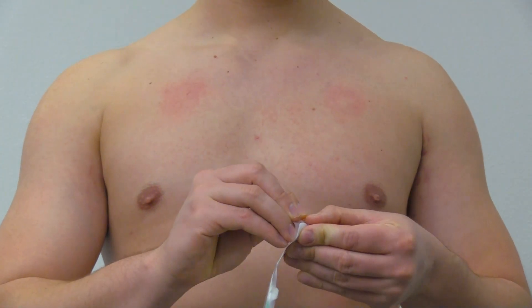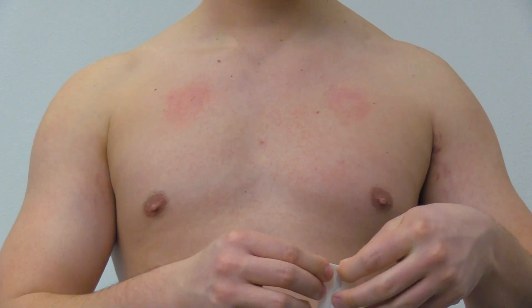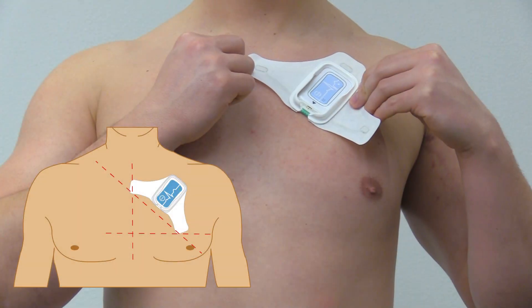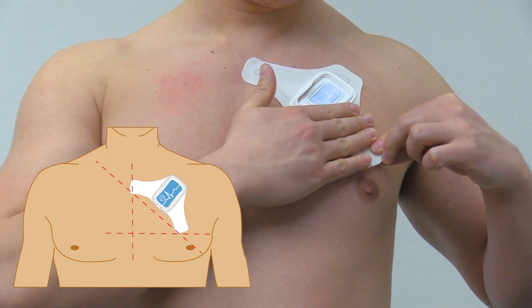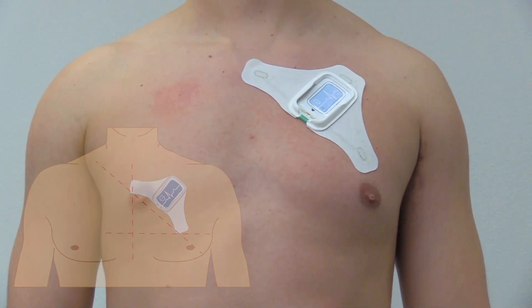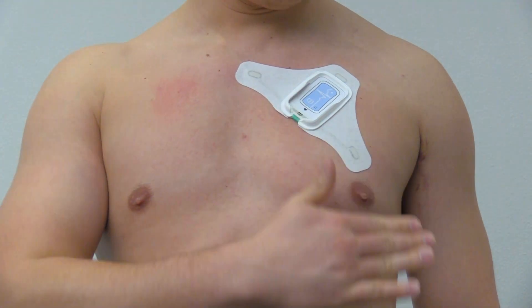Remove the patch electrode from the package and peel the release liner exposing the adhesive. Place the electrode on the chest at a 45-degree angle. The wings of the electrode should span between the sternum and left nipple, with the device body towards the left shoulder. Press firmly on all parts of the electrode.